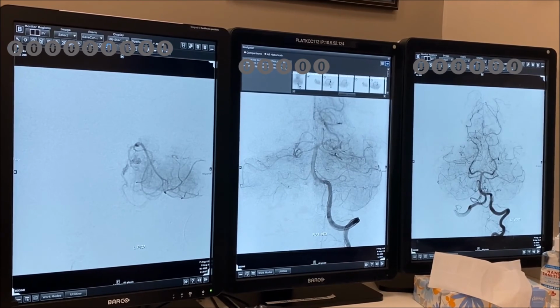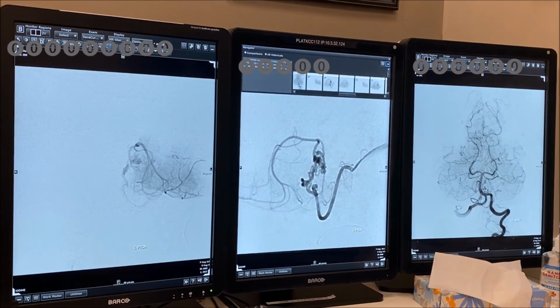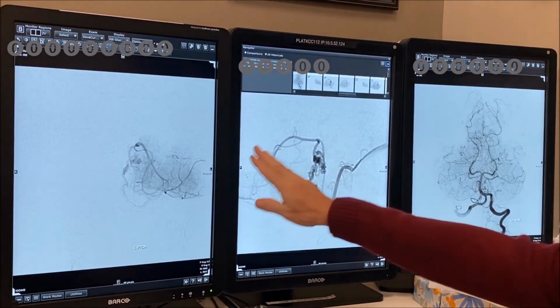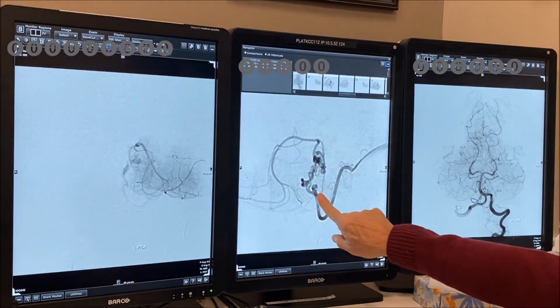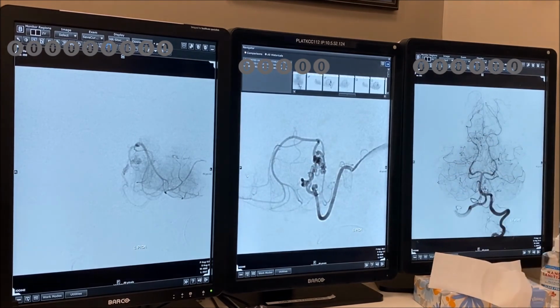Okay, so now we've determined, number one, that we can sacrifice this. I mean, if you throw emboli, it's going to be problematic. So that's going to be the key. So now comes how are we going to treat this thing? Any questions with this? Makes sense so far. Okay. So now here is the segment we're trying to close. We've determined that we can have collateral circulation coming backwards this way. So if you ligate it here, it will stay open, with the possibility of getting resupply in. And once you close this, you have no access to it.